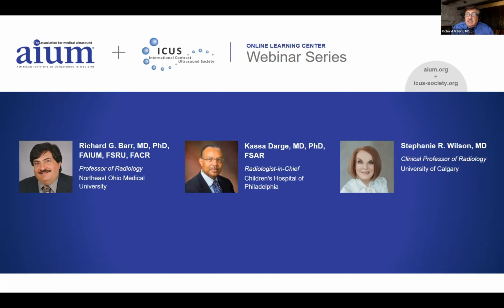But Cindy does almost all the examinations by herself. I like to say she usually knows what I want before I know what I want. So she performs the majority of the exams. Ideally, I like to be there and look at the exams. If there is a problem, then I do go in and I do scan occasionally when it's a very difficult case. But I would say greater than 90% of the cases are done without me in the room, and I just read them after they're done.